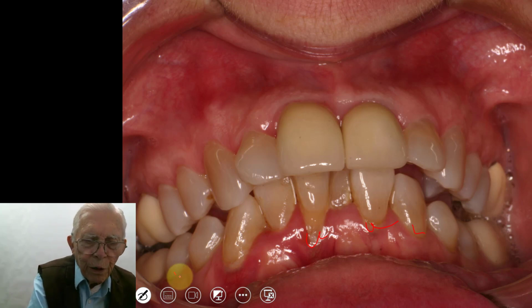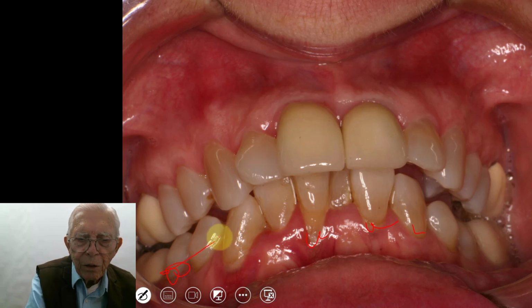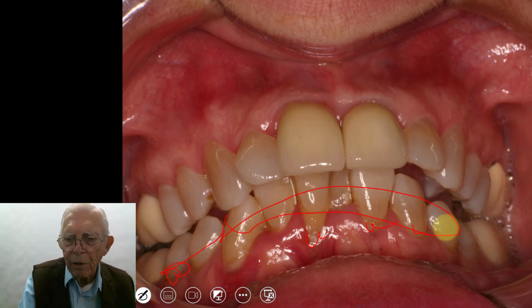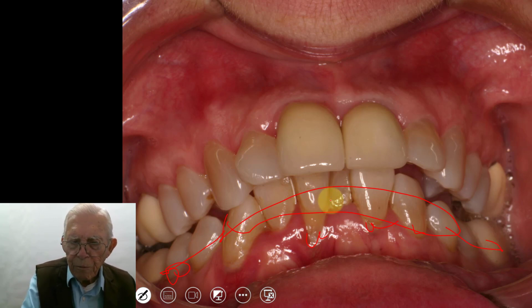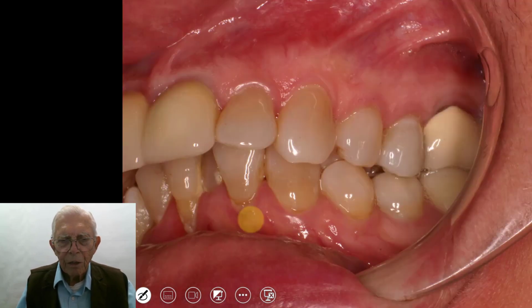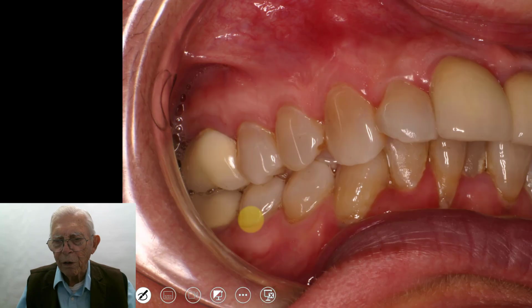And then you're going to put a lip bumper back here, and it's going to come up and have a deal in this part of the mouth that'll keep the lip pressure from pushing against these as we expand those teeth. And you can do that, but you have to be careful and keep this in. Now that's the same way over here.